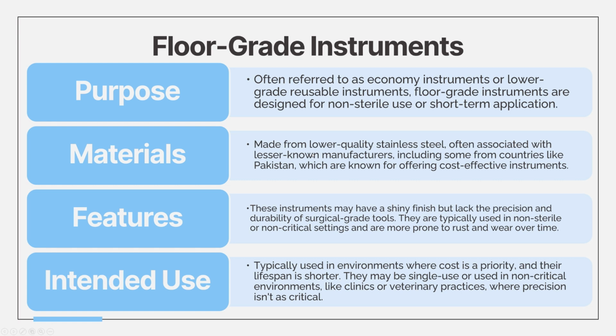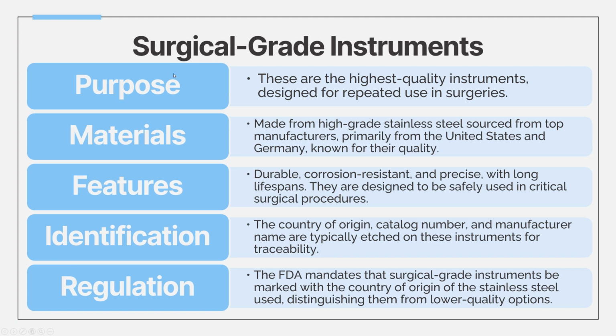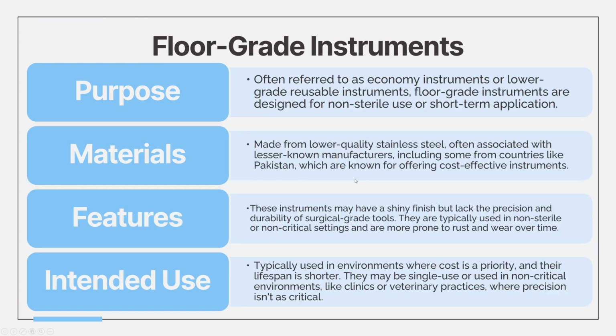So we would have a dedicated transporter going around the hospital, picking up instruments from the OR, then dropping them off to the contam. And then they would also have the transporter go around the clinics, let's say at 3 p.m. That's a designated time for picking up instruments that were used from the clinics, or sorry, floor departments. So I say clinic because a lot of hospitals call the departments that are not the OR clinics for the most part.